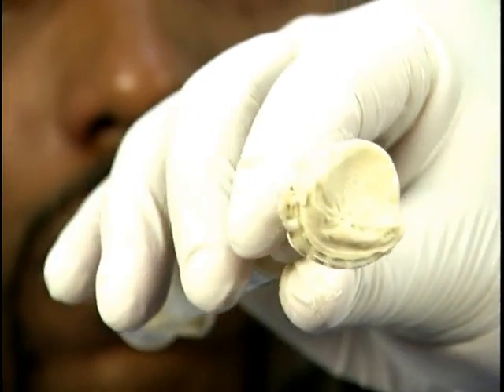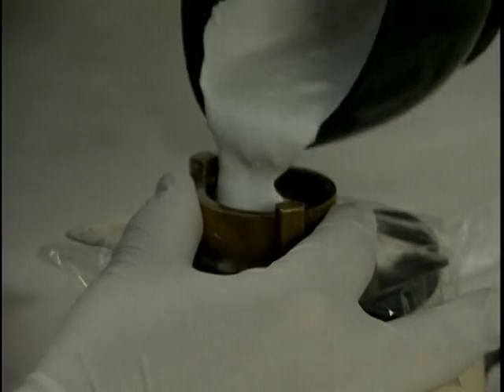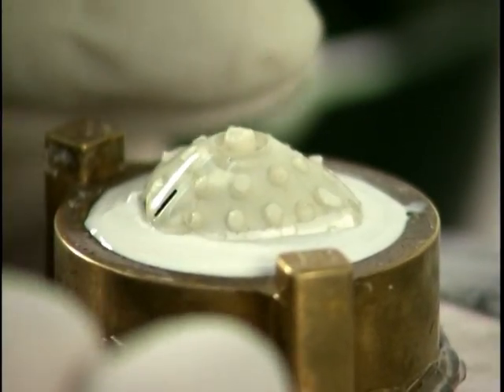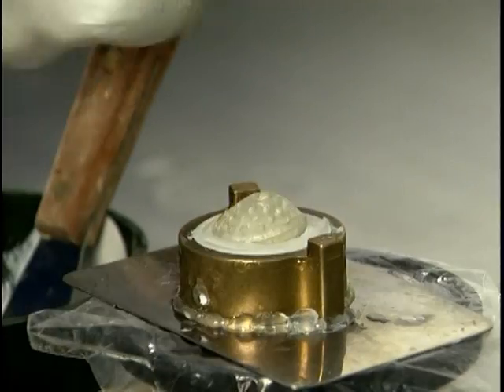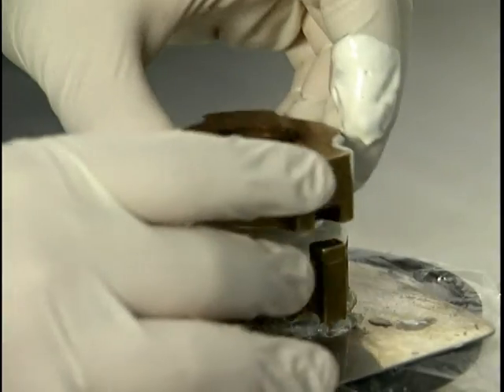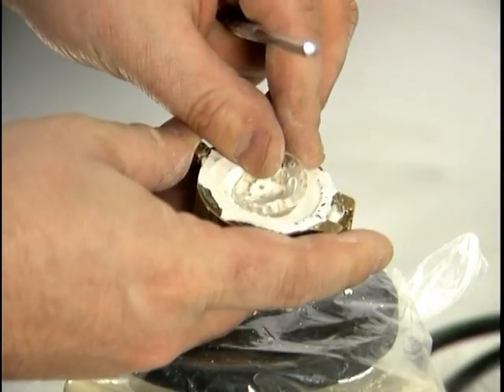Once the alginate is set, a lab plaster mold is created in order to pour the wax master. After mixing the lab plaster, decant into a flask and vibrate until evenly dispersed. Once the plaster is dry, release the surface and prepare for pouring the interior side. Apply a small amount of plaster around the base of the impression tray and then cover. Once the plaster sets, separate the mold, removing the impression tray and alginate.